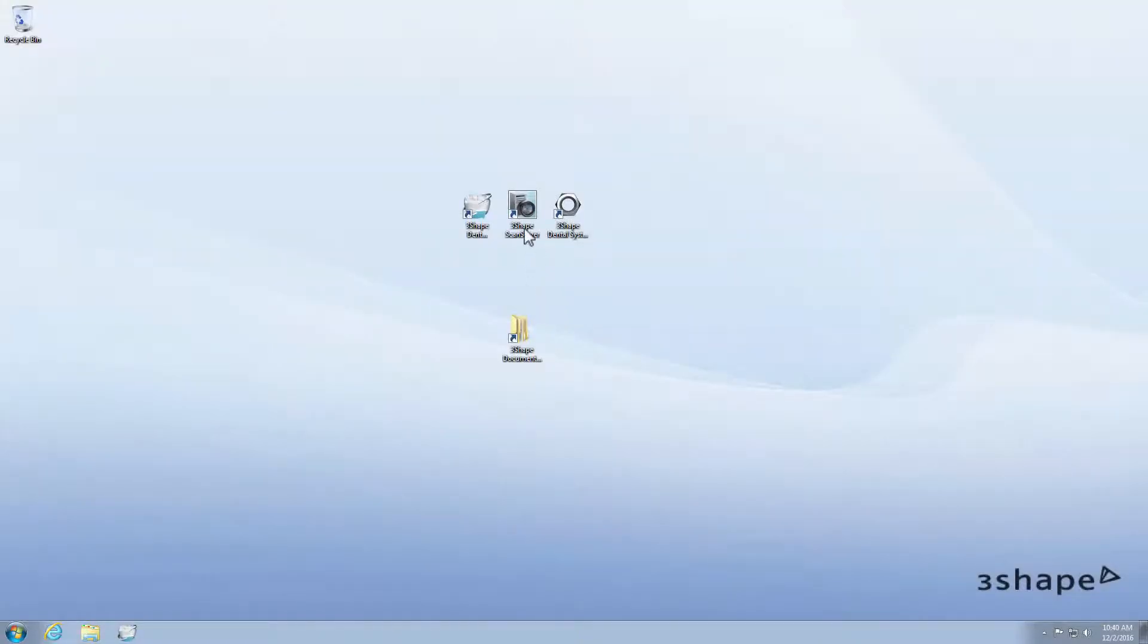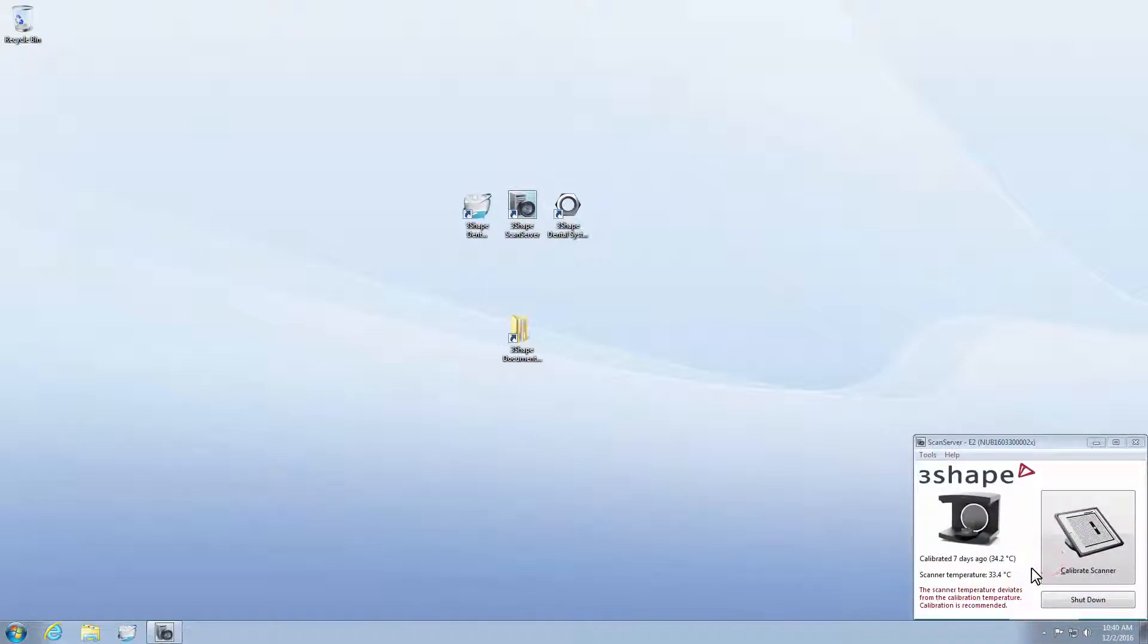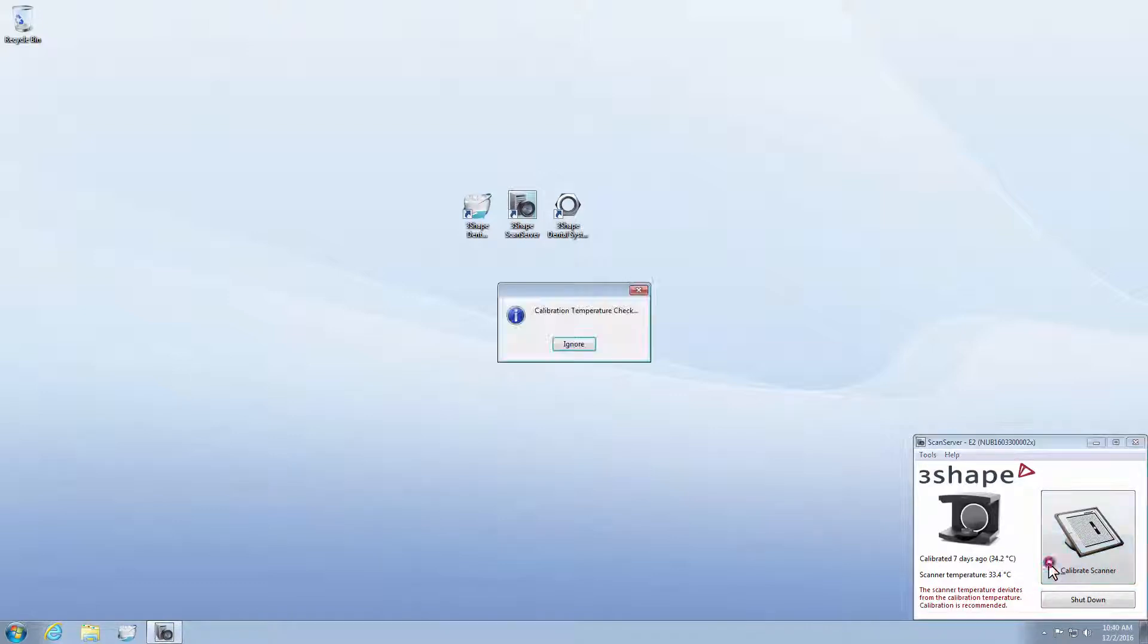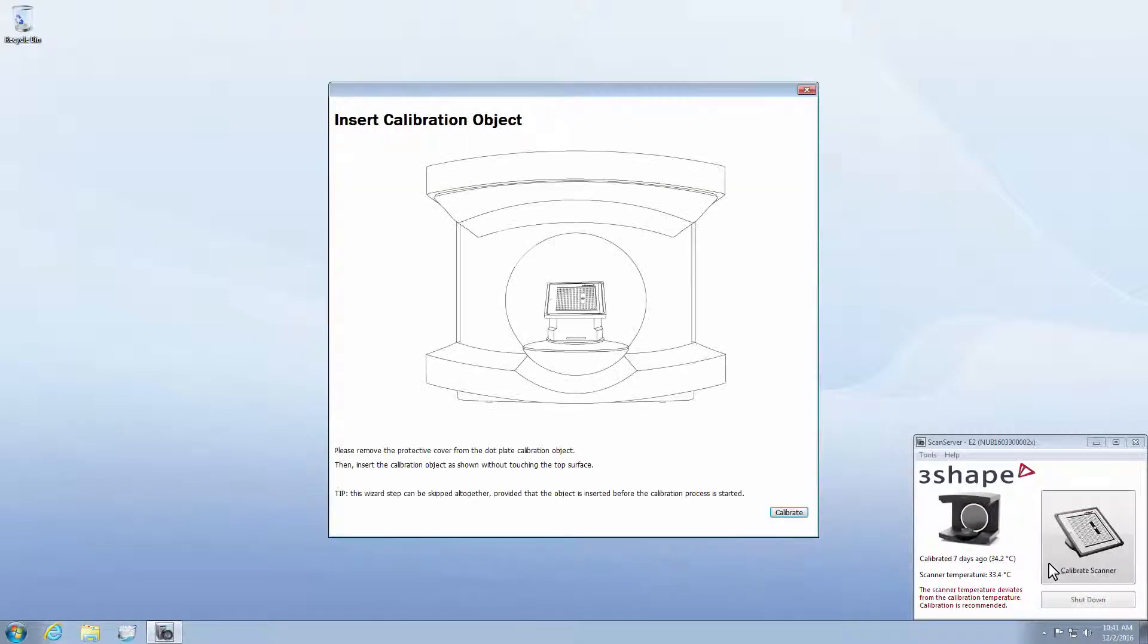The first step to calibrate the scanner is to click on the ScanServer icon on the desktop. The ScanServer window will appear near the taskbar, where you will find the time and date of the last calibration. Now press the Calibrate Scanner button. At this time you will see information about the temperature of the scanner. After the temperature has been checked, you will be moved to the next step.